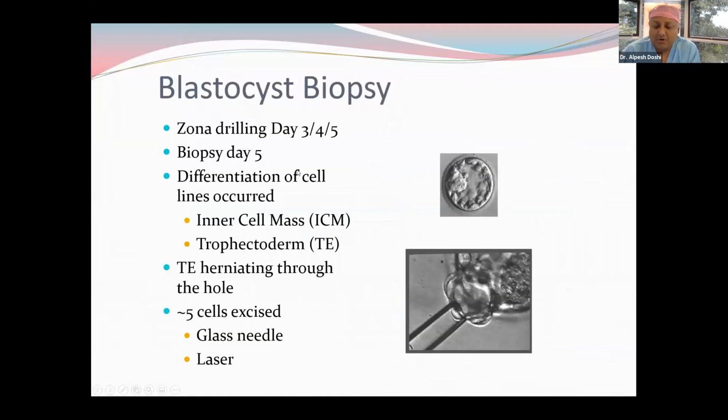I'm not going to be talking much about the other stages of embryonic biopsy, such as polar body biopsy or cleavage stage biopsy. I'm going to dive straight into blastocyst biopsy because this has pretty much become the gold standard now with any kind of PGT testing.